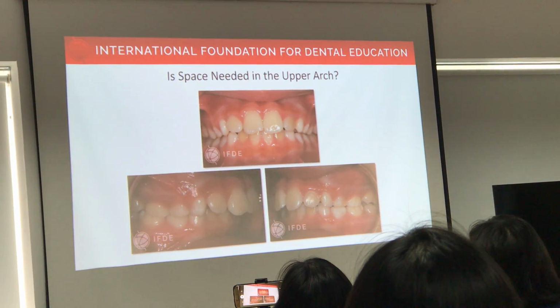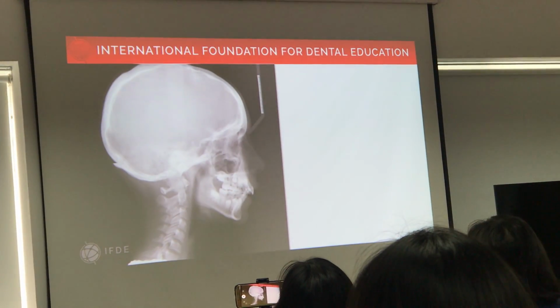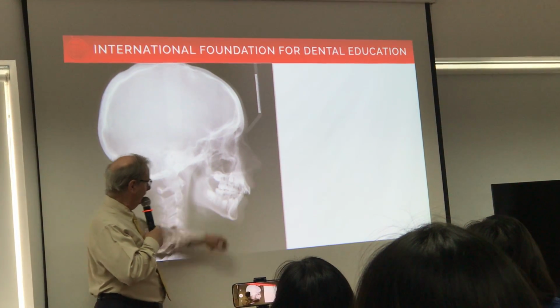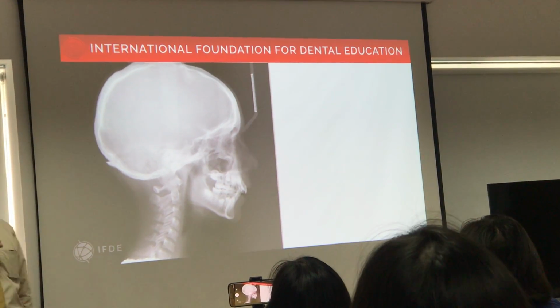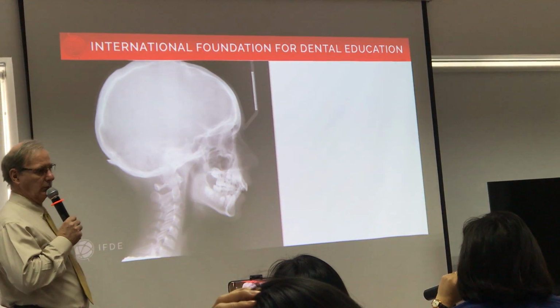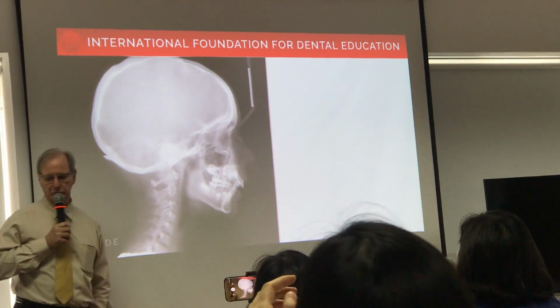Và ở đây thì nó có cái tương quan răng sáu loại 2, bệnh nhân này không có chỉ định là để di răng 6 ra sau, bởi vì thứ nhất là về mặt khoảng mà nói thì có rất nhiều khoảng, thứ hai nữa là về mặt của bệnh nhân. She has a very small jaw, thế bạn chỉ định là đưa hàm dưới ra trước. She has a tiny lower jaw, it's not going to get any better, you know.